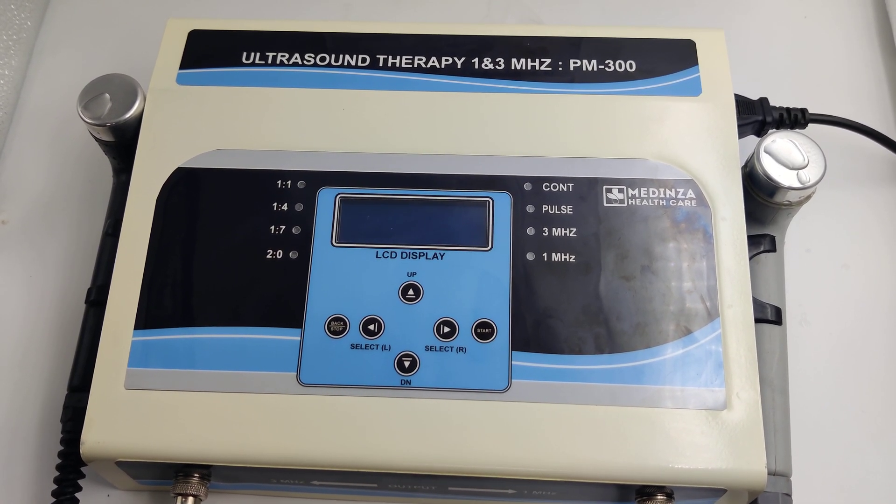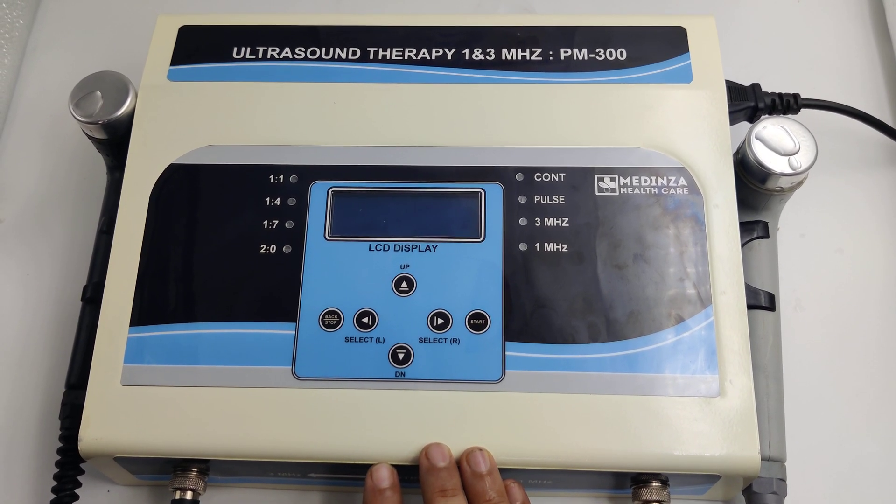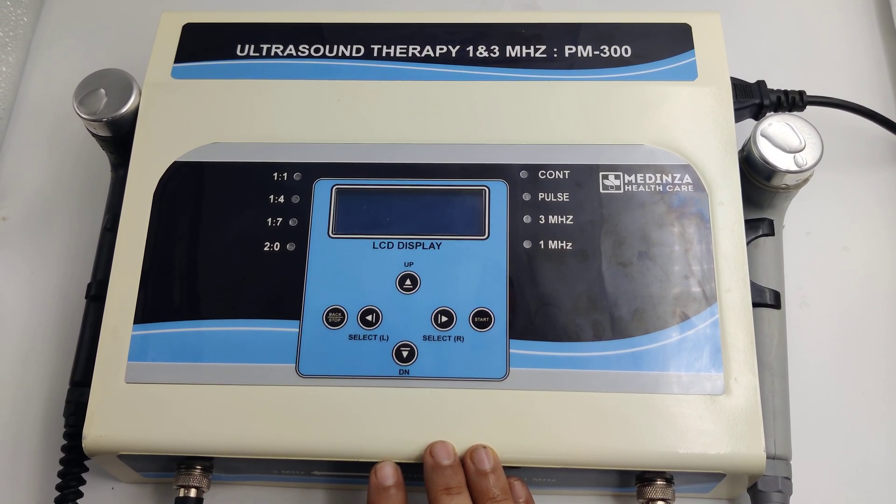Demo of Medinja PM300 1 & 3 Ultrasound Therapy Unit. It has inbuilt 45 programs along with a manual program.